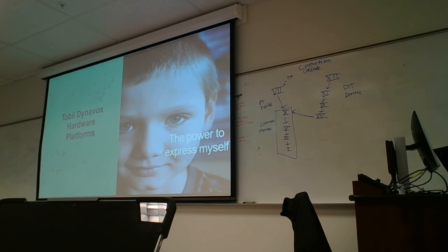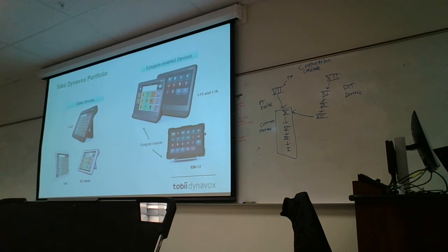Okay, so onto the fun stuff, the hardware solutions. Like I said, the SC tablet is our Apple-based product, so it is essentially an iPad that's in a speech case. Together, that's called an SC tablet, and it does have its durable medical equipment code, so it is a funded device that you can put through insurance. If you just get an iPad and put communication software on there, that would not be funded or covered by insurance.